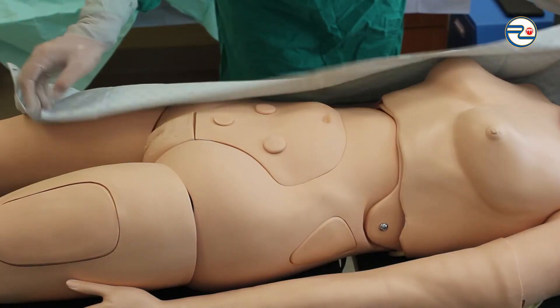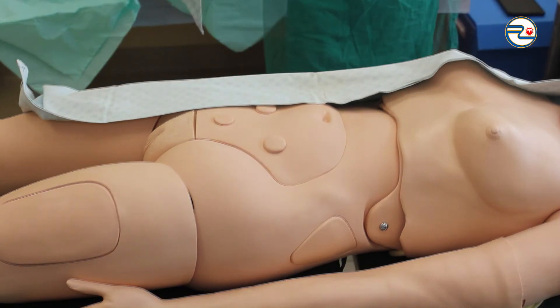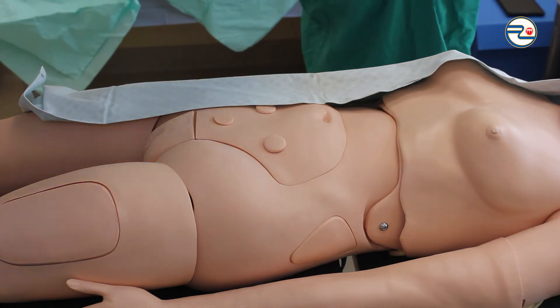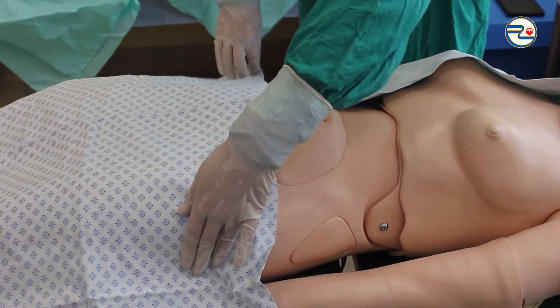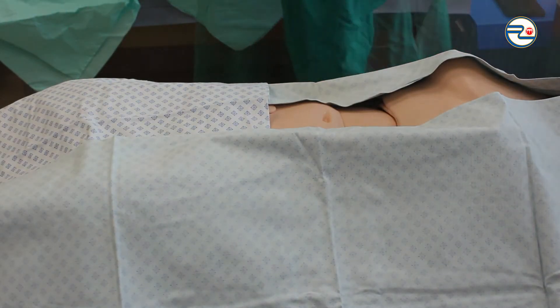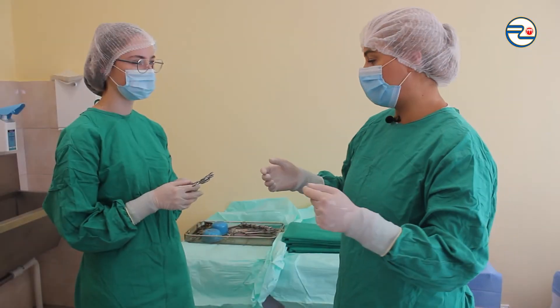I'm starting draping with the four smallest drapes. Placing the first drape closest to me on the side of the patient. I'm not bending over the unprepared field. I'm not moving a drape after I place it. I'm covering the operating field on all sides with the three remaining small drapes. The edges of the prepared surgical field should remain under the sheets.